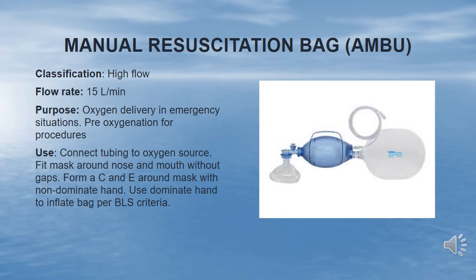Included with the bag is a connector for attachment to endotracheal and tracheal tubes, as well as to a face mask. The mask has a soft air-filled cushion to help maintain an airtight seal around the nose and mouth to ensure adequate ventilation. Tubing on the bag connects to an oxygen supply. The bag is self-inflating and has a one-way valve which allows oxygen from the bag to enter the mask and permits reinflation of the bag.